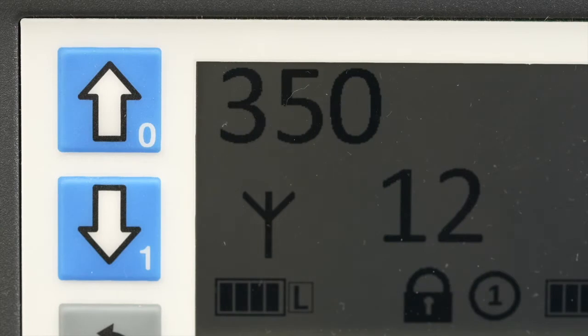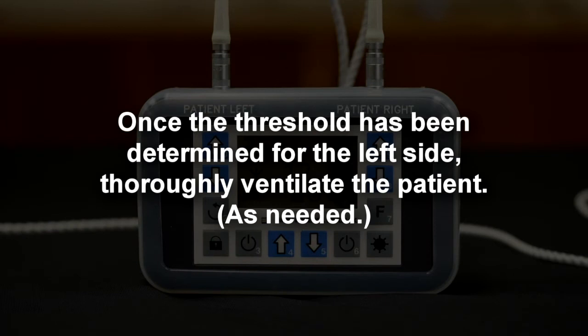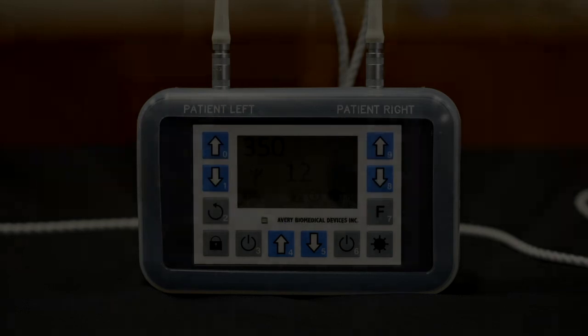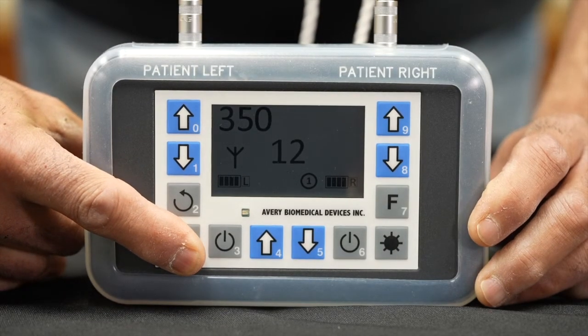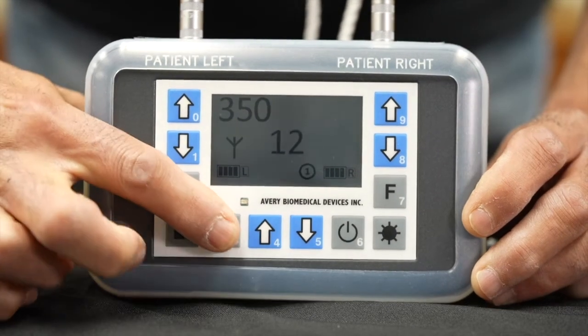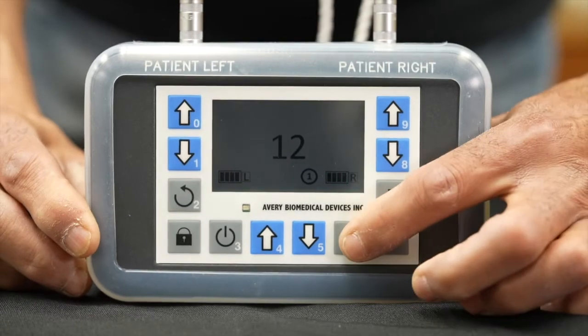Stimulation occurs when the three-wave icon over the antenna icon appears — inspiratory period. When the three-wave icon disappears — expiratory period — there is no stimulation. Once the threshold has been determined for the left side, thoroughly ventilate the patient as needed. Turn off the left side of the Spirit and repeat the above procedure, starting at step four, to determine threshold for the right side.